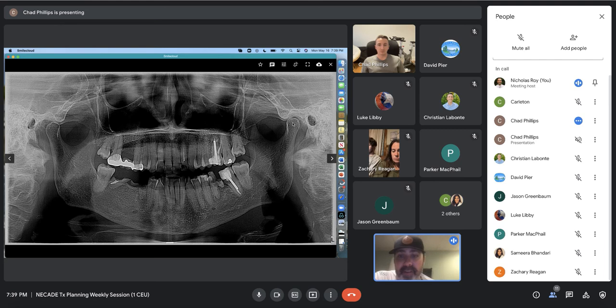But before we go there, let's ask the question: are those wisdom teeth? Those lower molars are third molars. As an employer of many recent graduates, there's still this mindset of all wisdom teeth need to come out. Not everybody here is that way, but I think there's a general kind of lack of understanding of when do wisdom teeth need to come out. Would anybody like to comment whether these teeth ultimately will come out or not, and why?